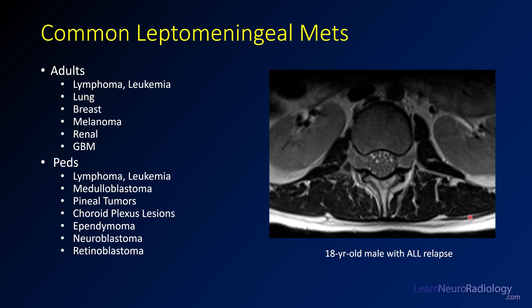When thinking about leptomeningeal metastatic disease, certain diseases are more commonly the cause. In adults, that tends to be lymphoma and common cancers like lung, breast, and melanoma. In pediatric patients, you have to think more about intracranial lesions likely to have leptomeningeal spread — things like medulloblastoma, pineal lesions, and choroid plexus tumors. Here you see a patient with relapsed ALL: the nerve roots are very thickened and expanded, with expansion in the neural foramina and almost no visible CSF — leptomeningeal spread of ALL throughout the cauda equina.